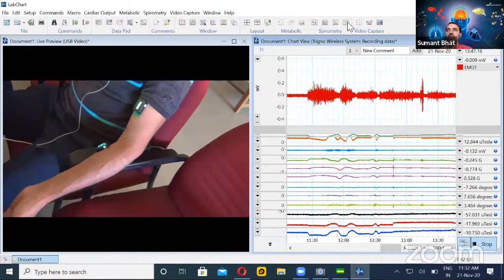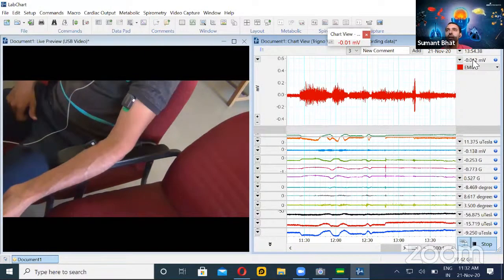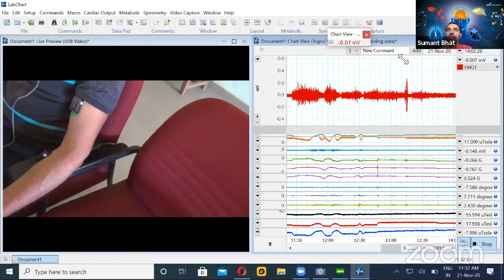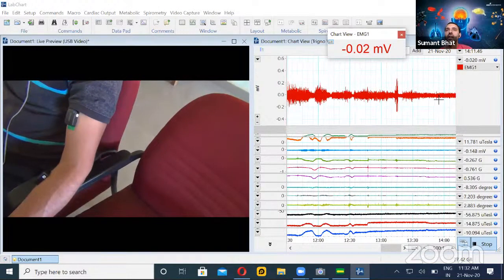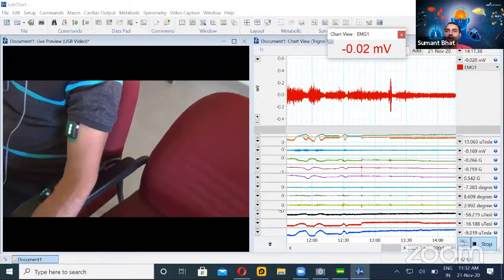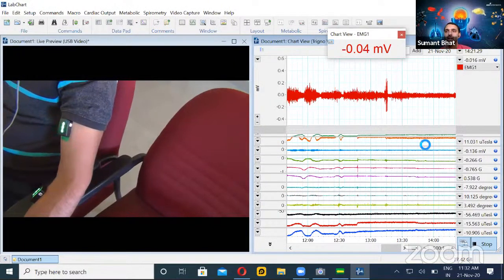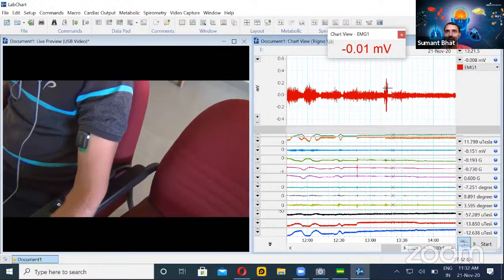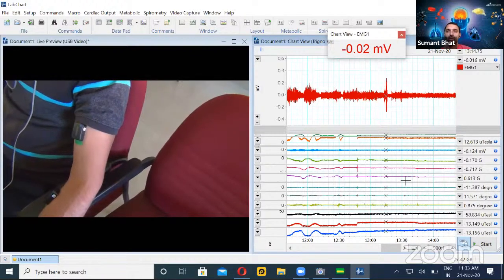Before we move on, I'll also show the reading panel. If you click and drag from the waveform, you will see a small box — the value panel, which we call the digital voltmeter panel or DVM. This gives us the instantaneous value as the data recording goes on. If you want to see previously recorded data at a particular instant, you can stop the recording and as you take the cursor to any point, it shows the value — for example, 0.02 millivolts.